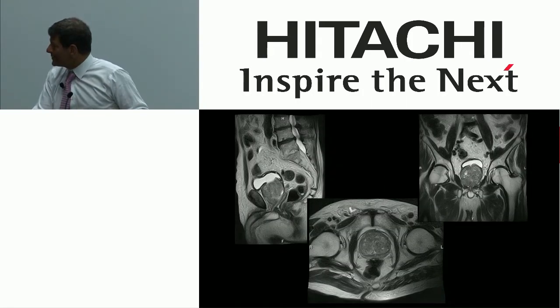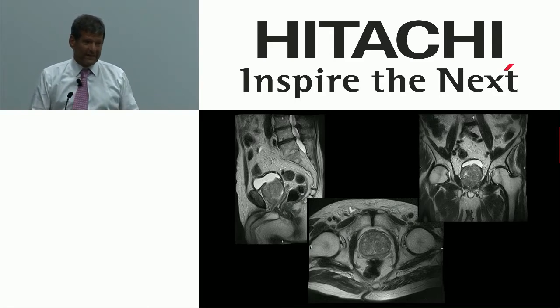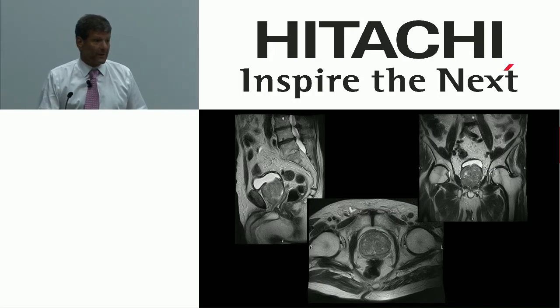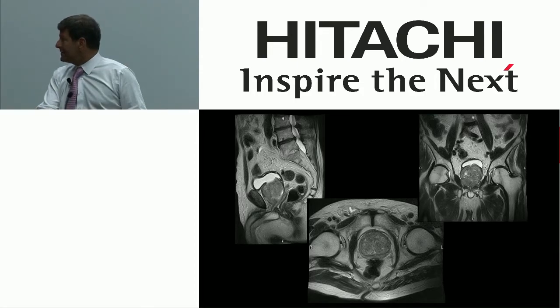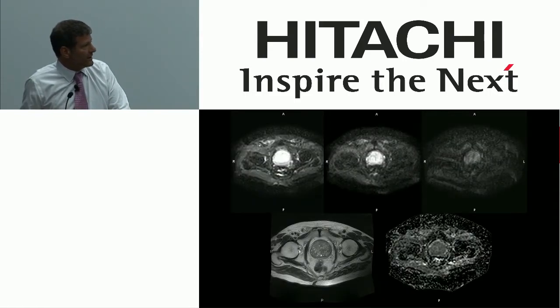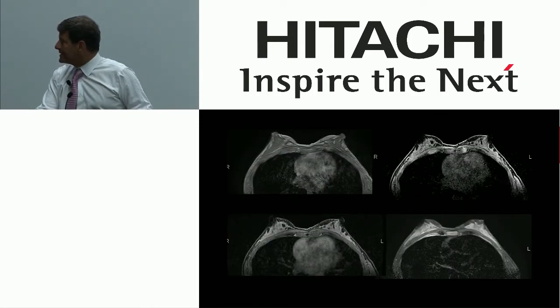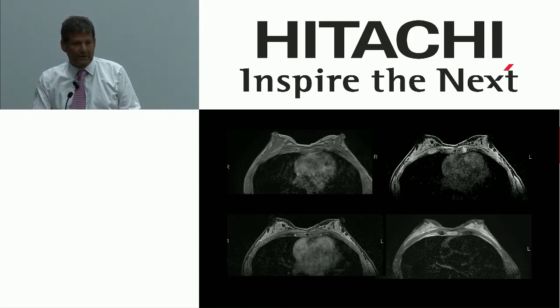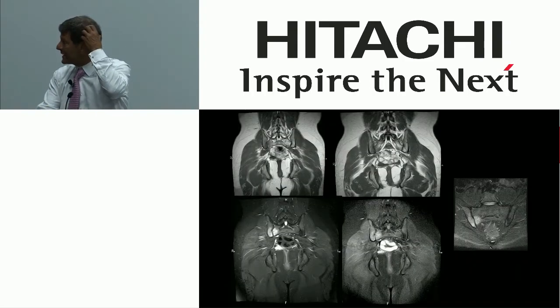Even prostate. Now, mind you, I would think the standard of care for prostate is probably a 3T scanner, okay, with sophisticated diffusion techniques and dynamic contrast enhanced imaging. But you know what? Sometimes patients won't go on the 3T scanner. And I'm pretty confident that we can deliver what we need, a quality ADC value, multiple diffusion weightings, and a quality T2 that can be used to fulfill the PIRADS criteria. Again, there's the diffusion we see on top, higher and higher B values. Again, really quite nice. And this happens to be a very small woman. Unfortunately, it's the only example that I had that I could pull from, but typical multi-phase breast imaging. It works just as you'd expect, and frankly, I would not hesitate to do breast imaging on this particular machine.